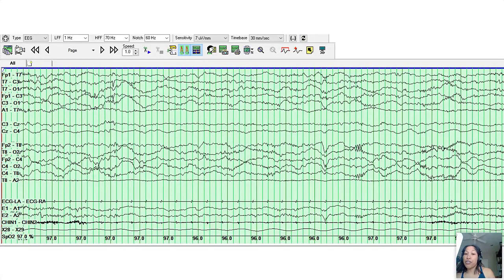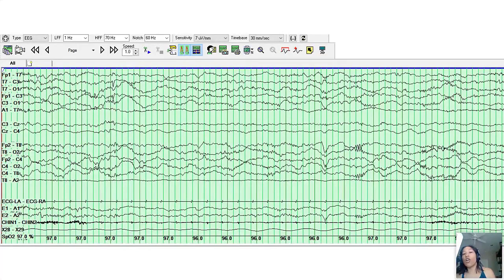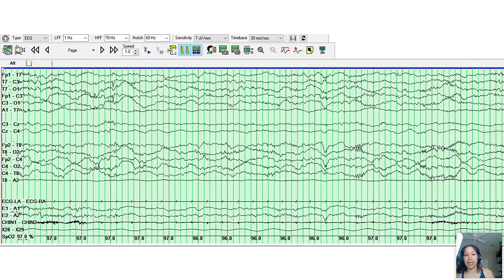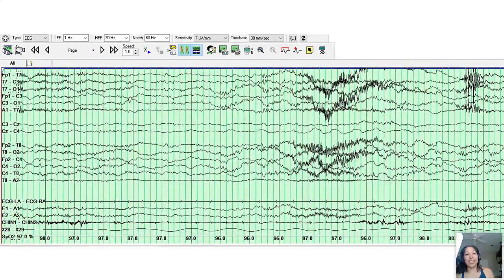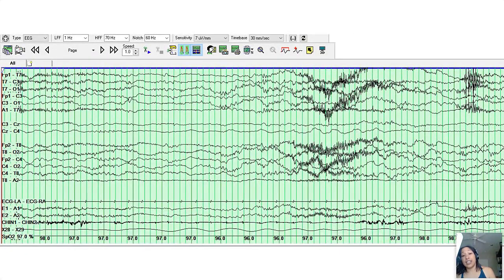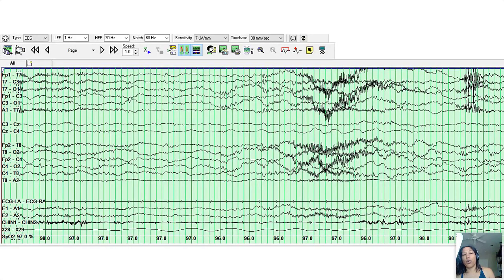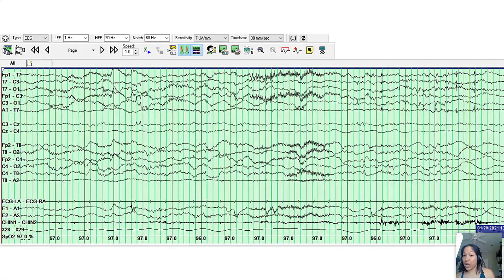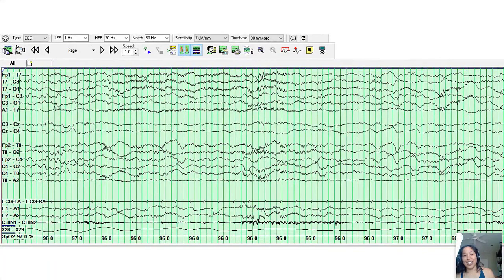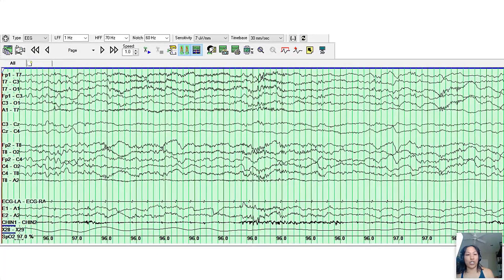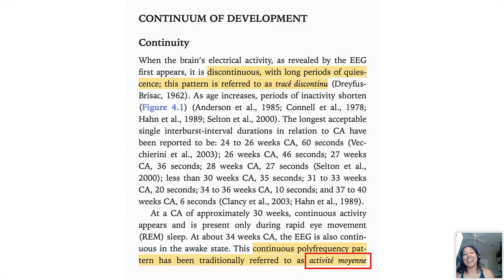I've seen some neonatal EEGs that are marked in various places with 'oh where's the PDR, PDR seems slow' and it's like no, no, no, we don't expect it yet, this is a 36 weeker. What we do expect is kind of like what we see here, it's an admixture of frequencies. We see some delta frequencies, we see some alpha frequencies, we see some theta frequencies and they're all admixed, and this is what we would expect in an awake baby.